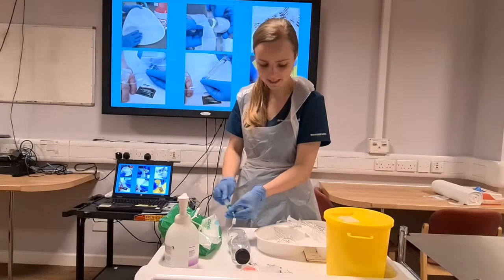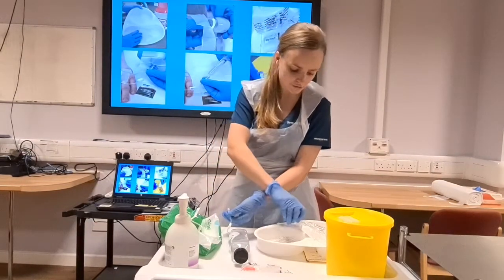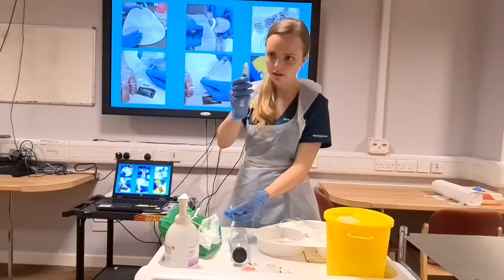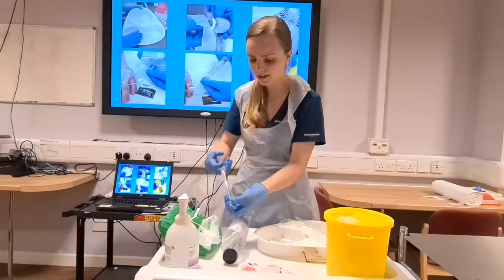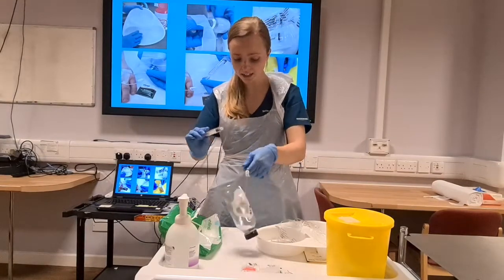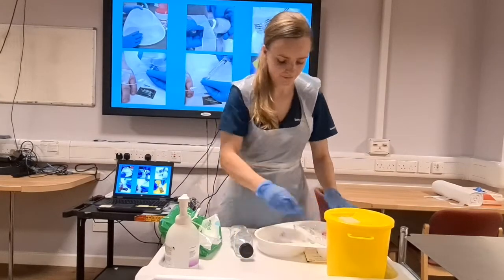So all my medication has been given, so that is no longer my key part, so I can throw that down, get in my flush, protecting my key part, again looking for air bubbles, pushing it in, unclip, and then clip, and that is it. That's my IV done. I'm going to tidy up so that I don't leave any mess. And I sign and I'm done.